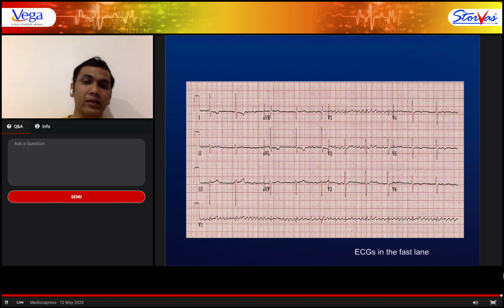Now, you may argue, why are we worried about an atrial arrhythmia conducting to the ventricle when I just mentioned there is a problem? It can actually be treated by cardioverting this patient or reverting the atrial arrhythmia. But the sine qua non of a patient in atrial fibrillation, which is what this is, where you can't make out the P waves properly, is that there has to be irregularity in the ventricular response.